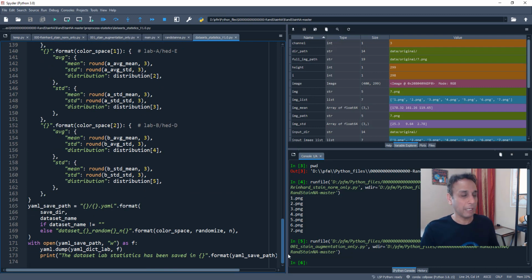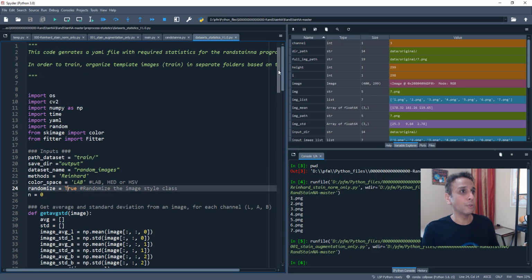No point in going line by line. This is not how to do Python stuff. This is not Python basics, but basically a technique, a process that I'm trying to explain here.